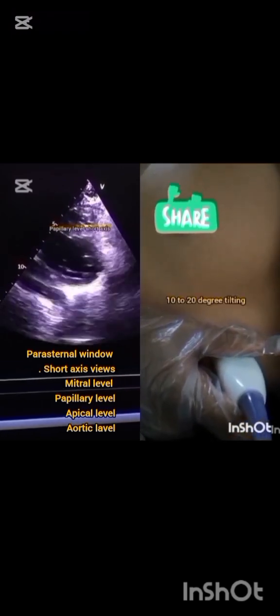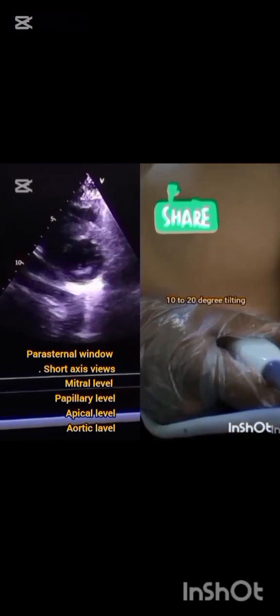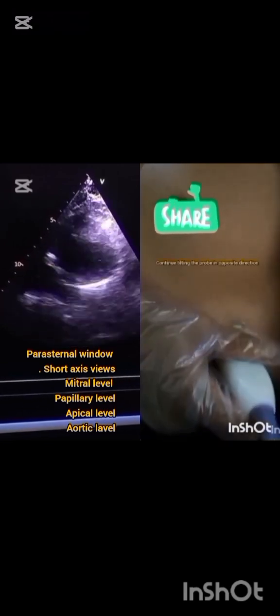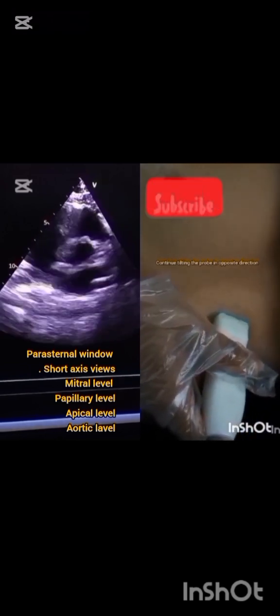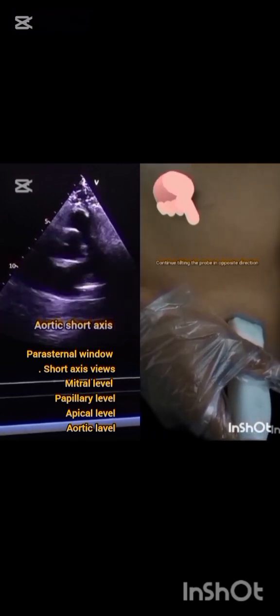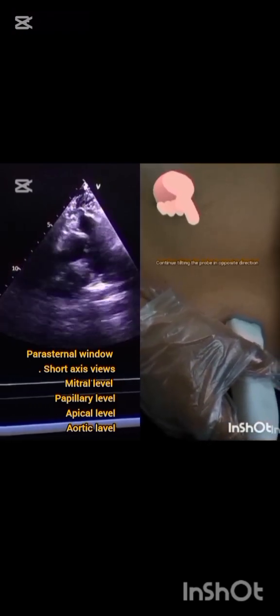The second is the papillary level. You see the papillary muscles in this view, and next you will see the apical view. In all these views you can see wall motion abnormalities and also muscular septal defects. And the last, you can see the aortic valve level. Here in this view you can see the pulmonic valve, aortic valve, and the tricuspid valve, and also see the morphology of these valves.